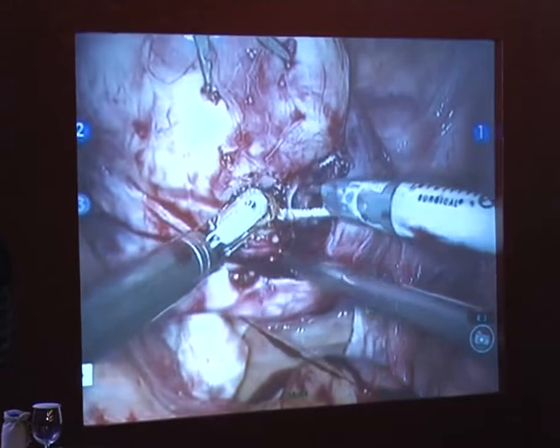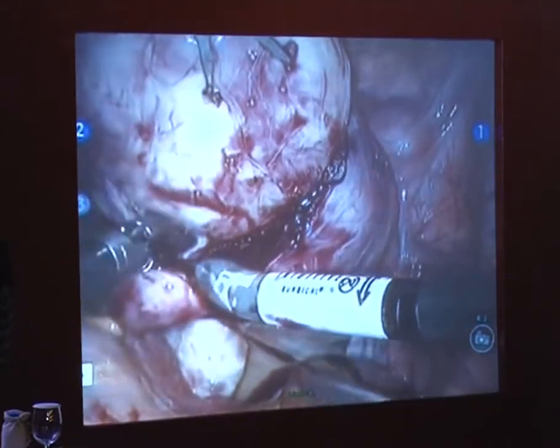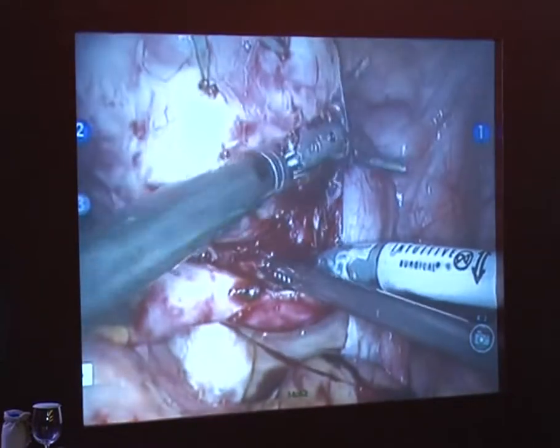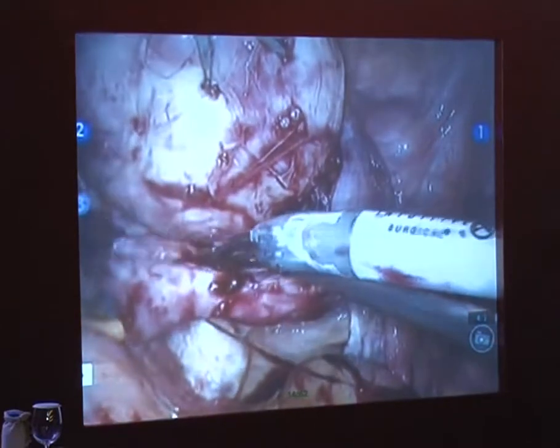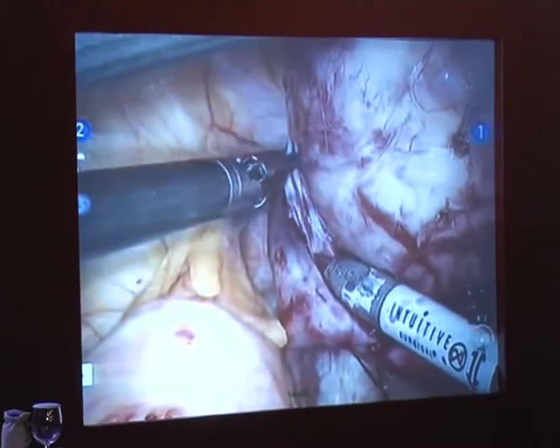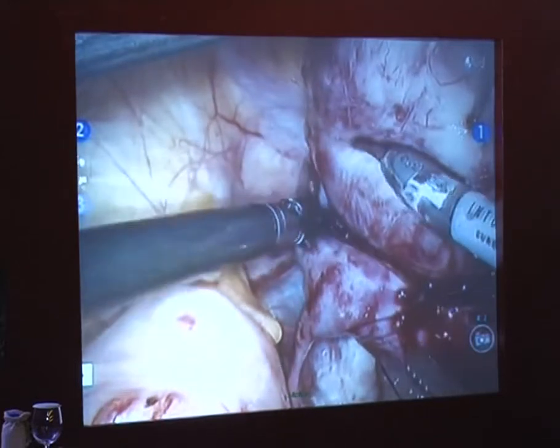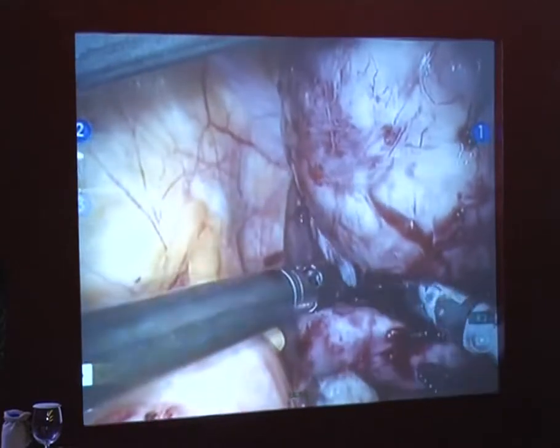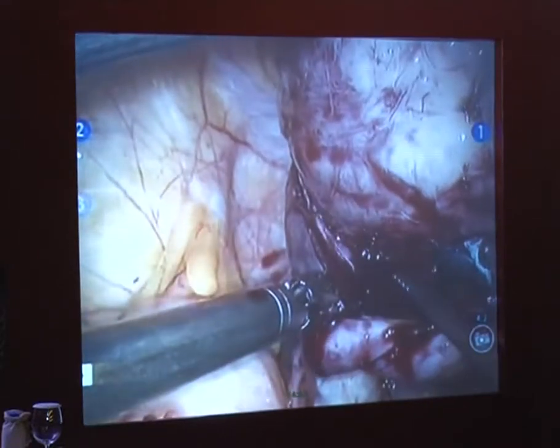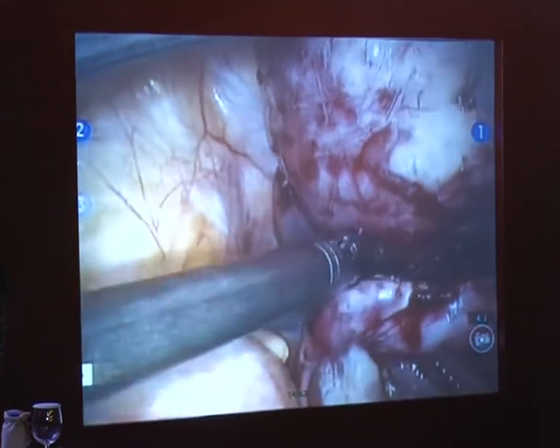This is a good-sized myoma. She's definitely going to feel a heck of a lot better when this is all done. Doing some big myomas today. So I'm just hugging the fibroid. Again, you can see here the beauty of the articulation, the value that this brings to a myomectomy. Ten years ago, this is one of the first applications where I really found value, to do the myomectomy with the robot, because at the end of the day, you have so much control over the enucleation process. It's really wonderful.